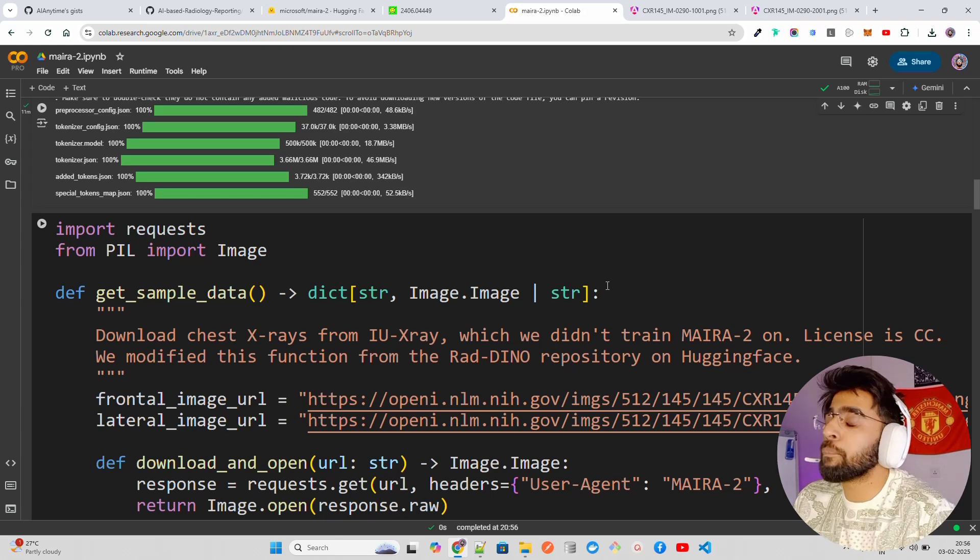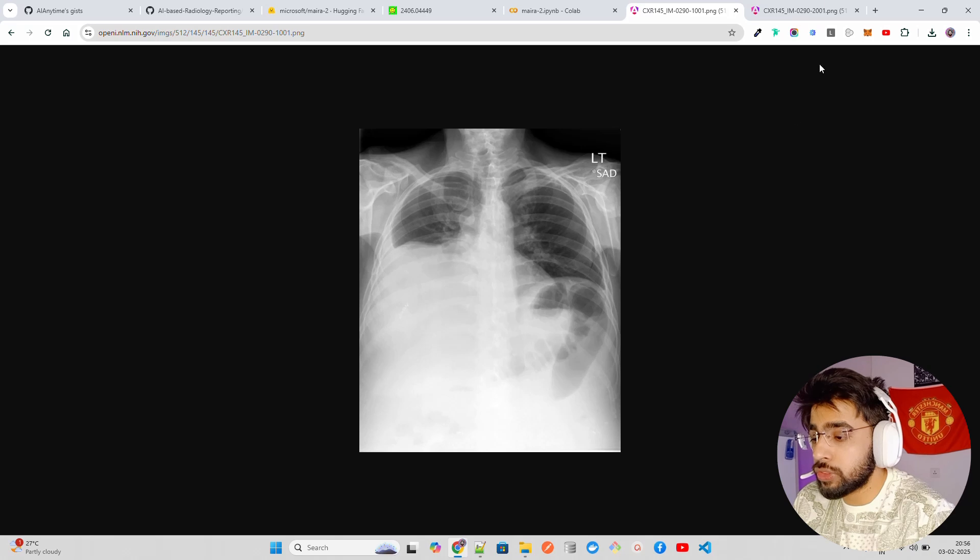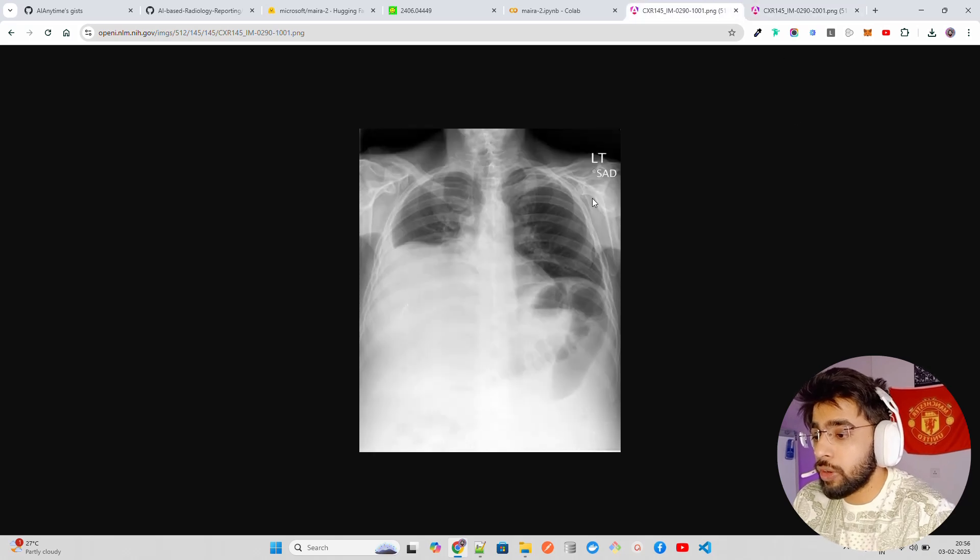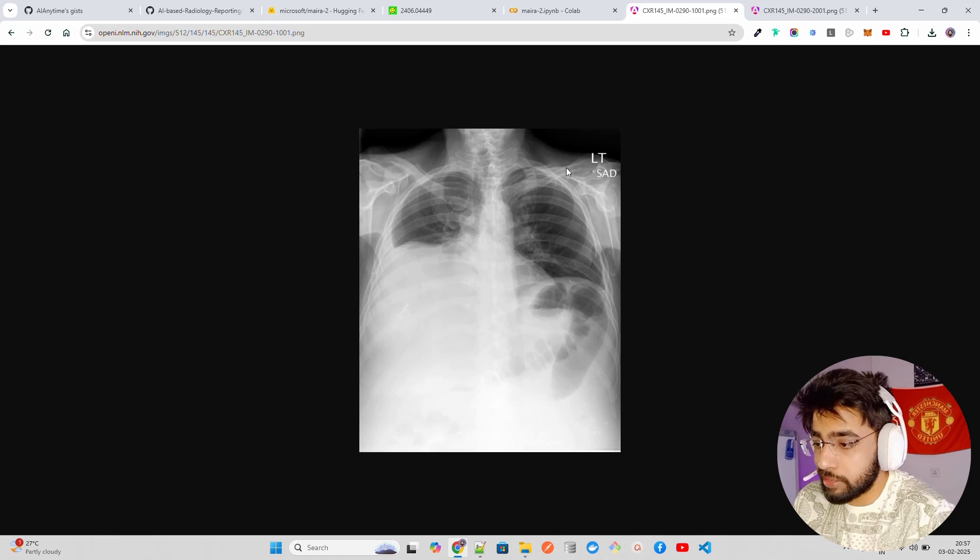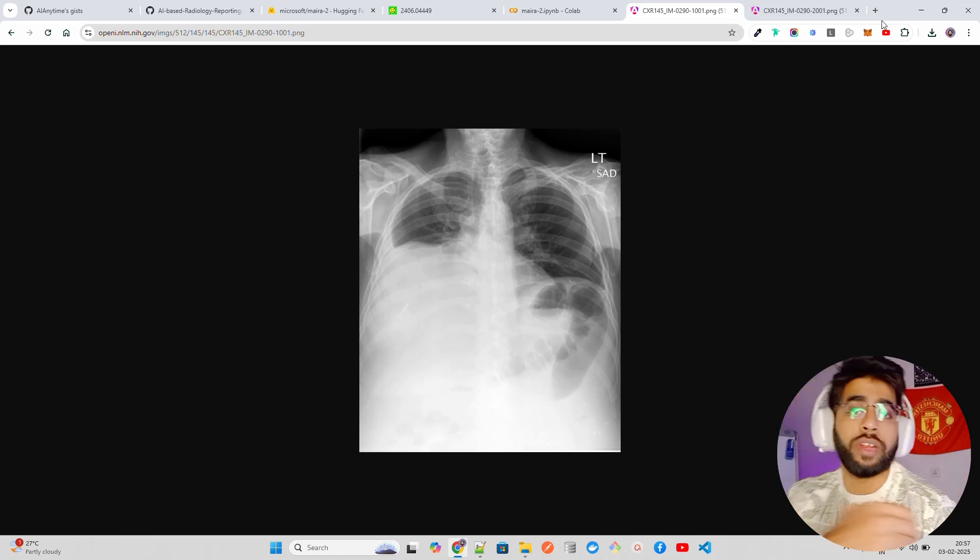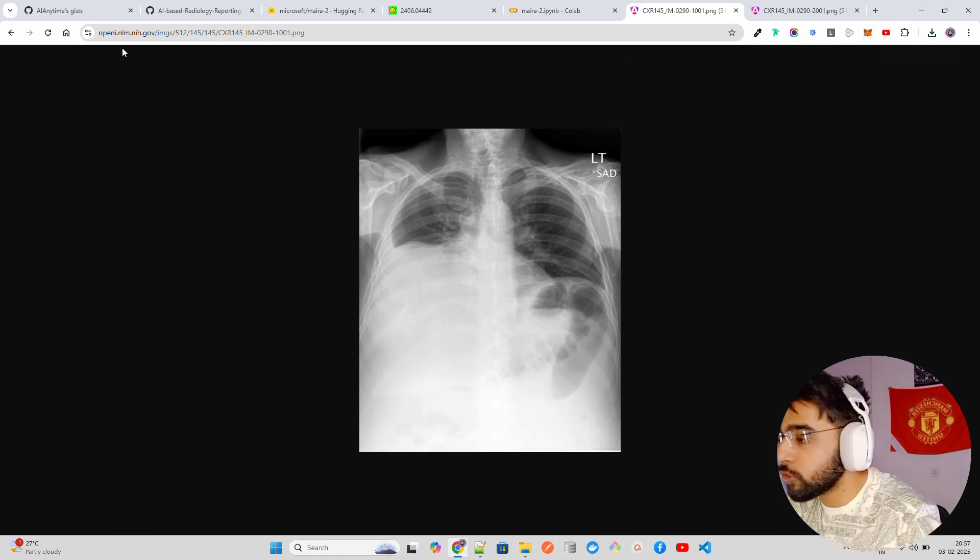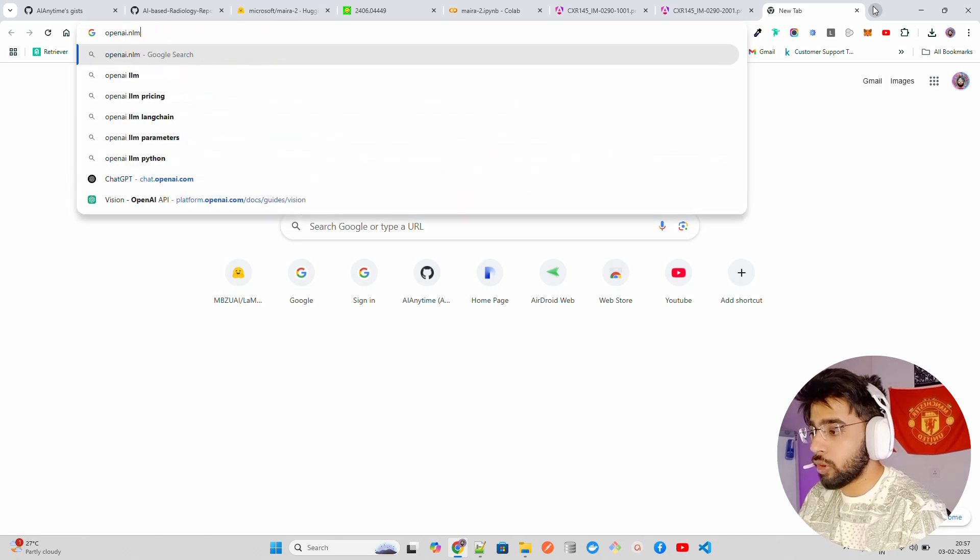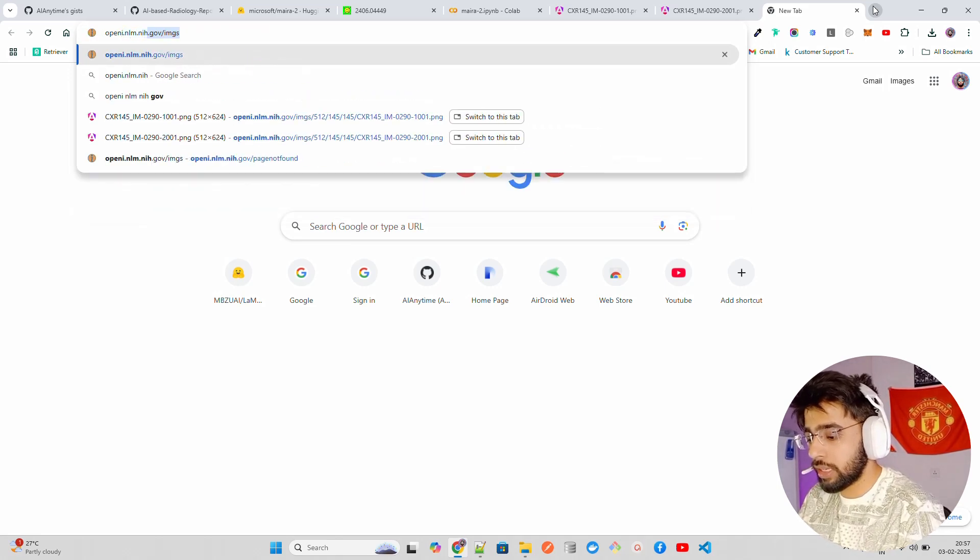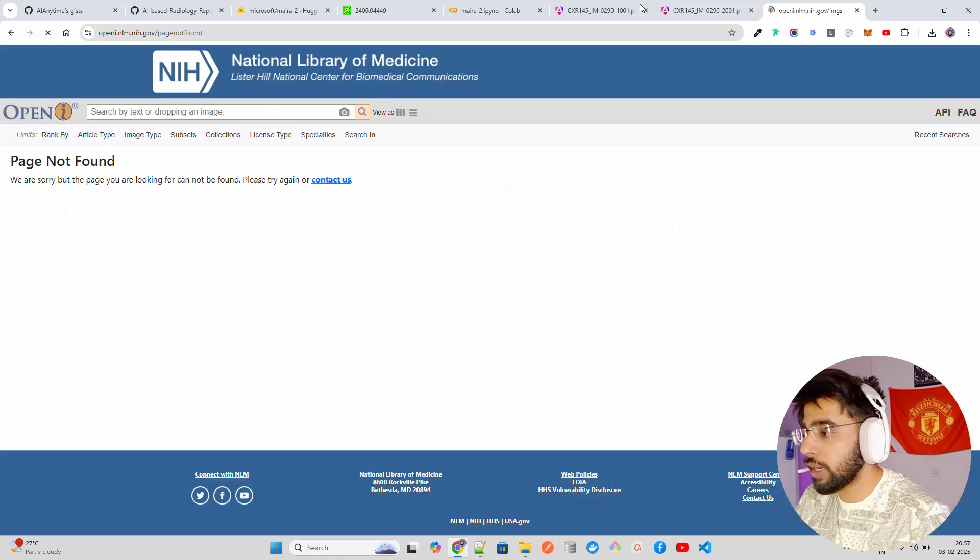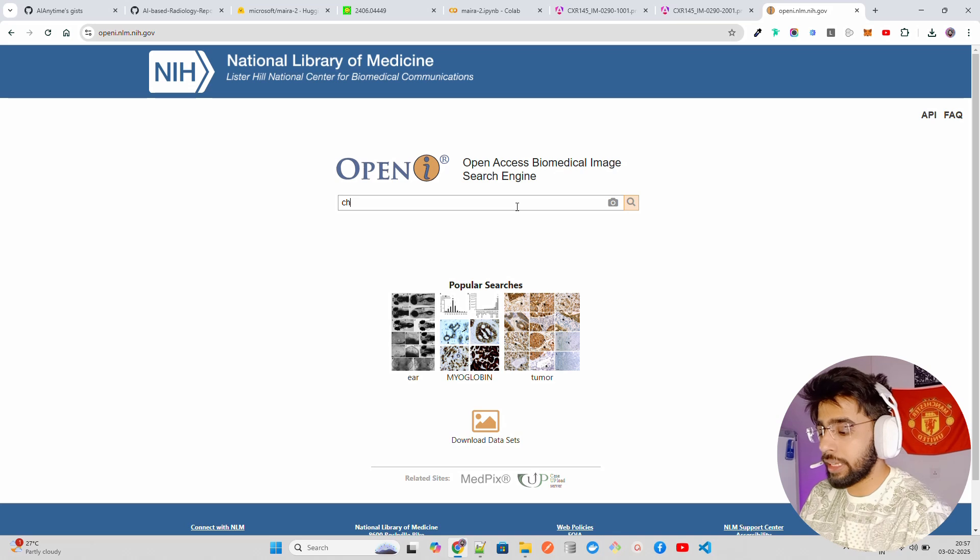We are going to use these X-rays, frontal views and lateral views. You can see this is lateral views of a chest X-ray, this is the frontal views of a chest X-ray, and this is coming from openi.nlm.nih - not OpenAI, we are so obsessed with OpenAI - it's openi.nlm.nih.gov.